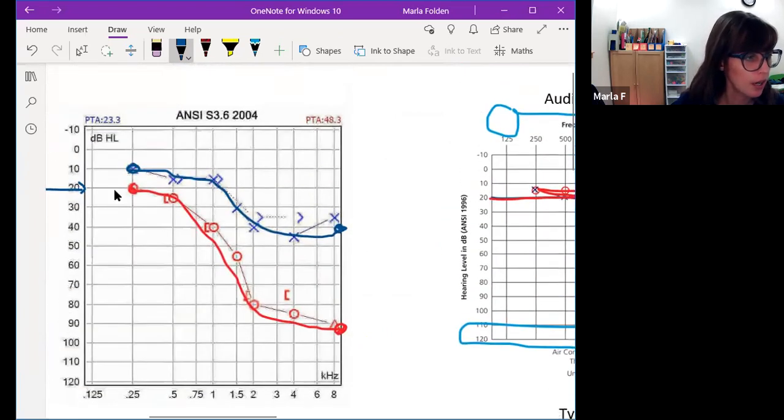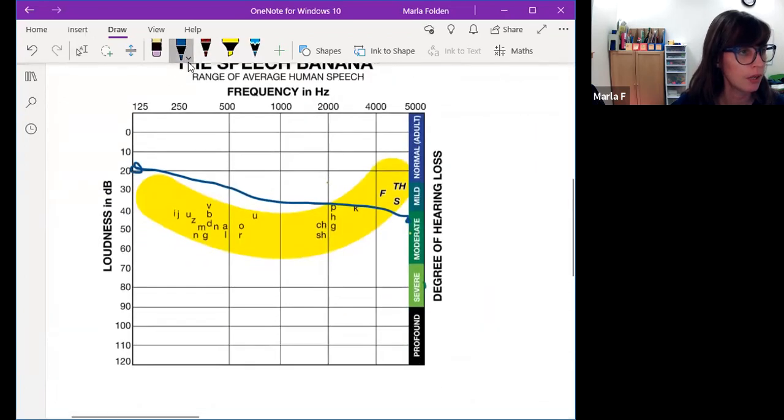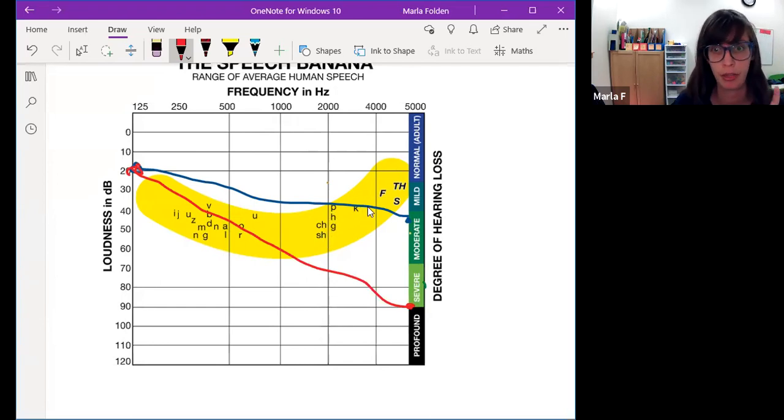They're going to start here at normal hearing and it's going to go way down there to 90. Let's see what that looks like for their right ear. Remember, right red. Starting off pretty normal, and cruising way down to about 90. What is that going to mean for that person in terms of the speech sounds they can hear? Everything above the line, they can't hear it. So that means in their right ear, they can't hear shh, chh, gh, ph, hh, ch. That's a lot of sounds. That means if you're trying to give this person verbal instructions, they're only hearing maybe half the word. This could be why some of our students are misbehaving because they can't actually hear.